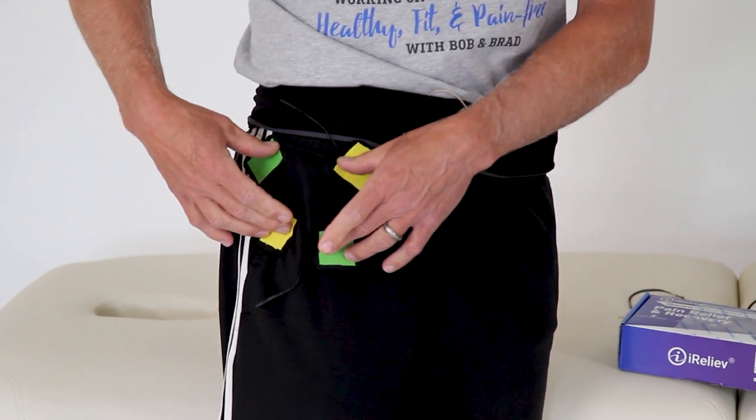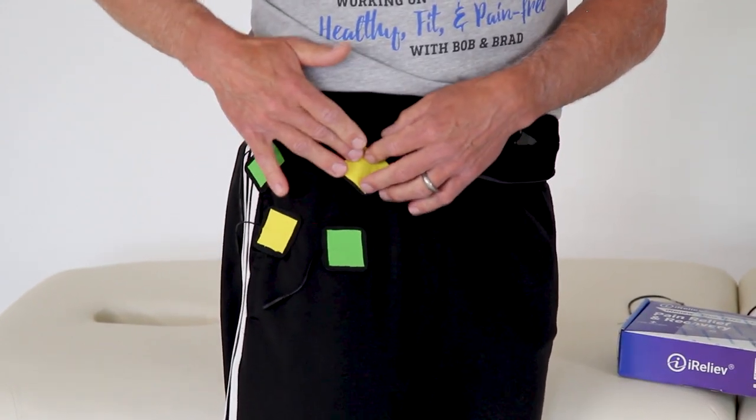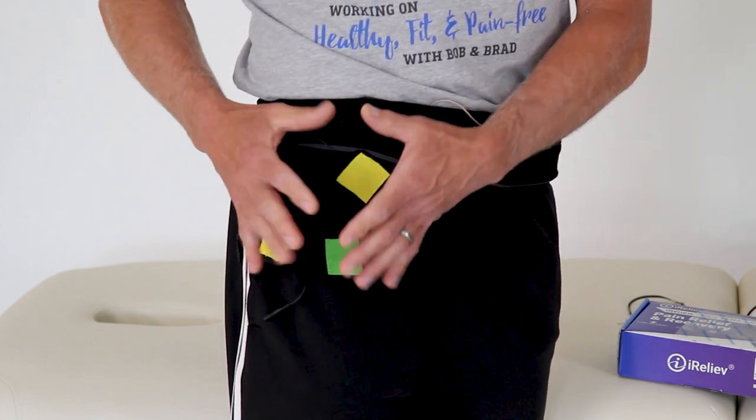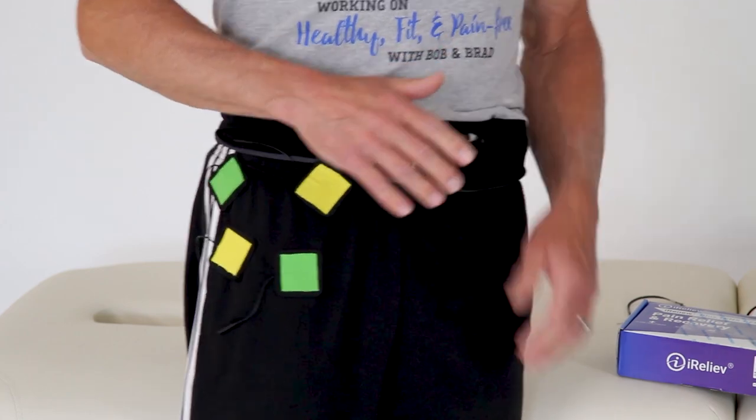What happens is when electrodes don't have good connection, either because there's movement on it, weight bearing or whatever, they tingle more. And it can be a little uncomfortable. It's like when they start to wear out, too.